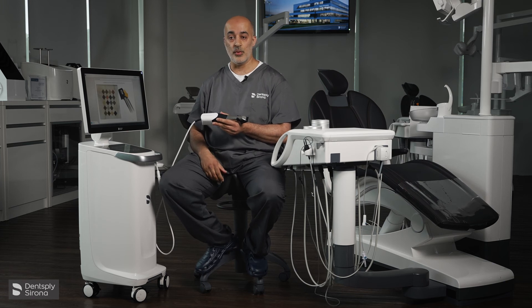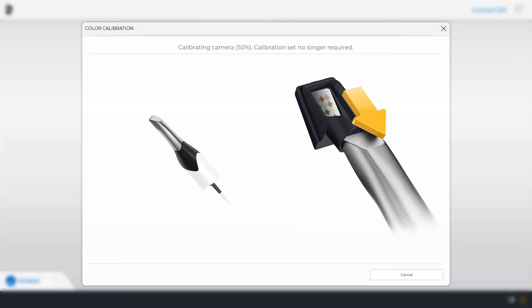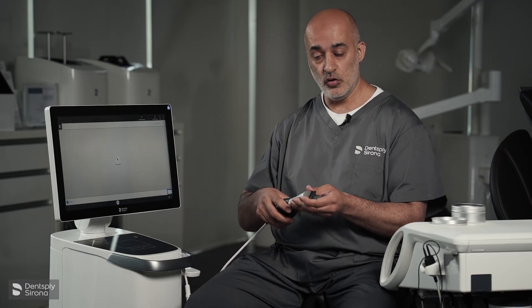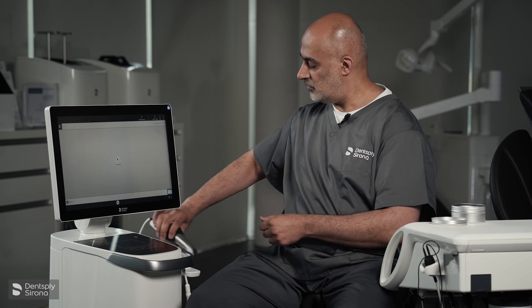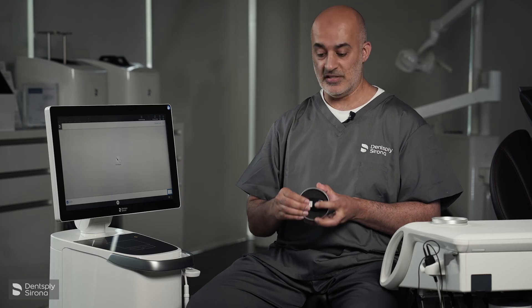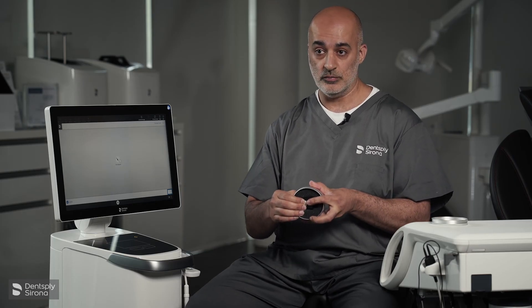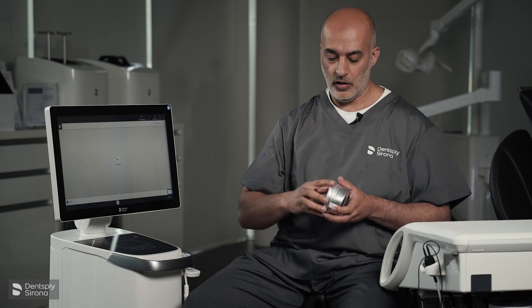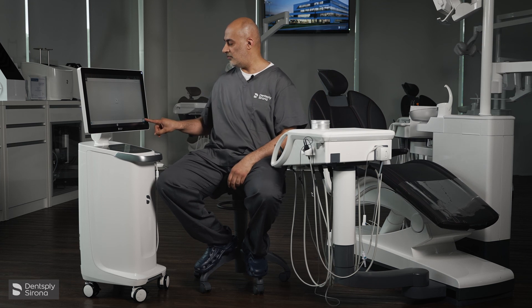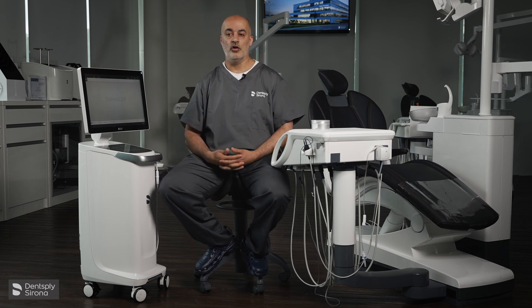Select OK and the calibration process has started. It takes roughly about 30 seconds. It says colour calibration is complete. Select OK, then remove the calibration set. Replace the camera and place this back correctly — it goes in upside down so the colour diamonds are not visible. Close the box and put it away. You can then exit onto the Cerec or Connect software.